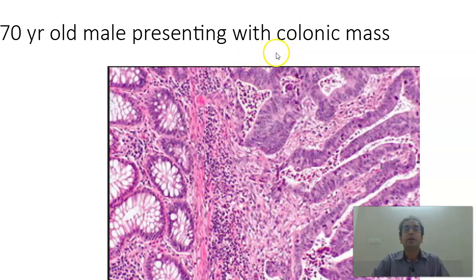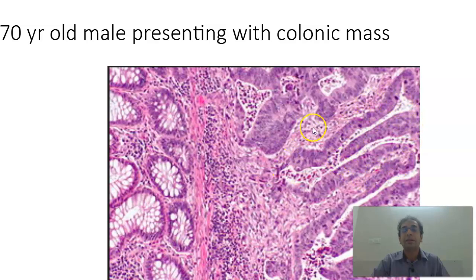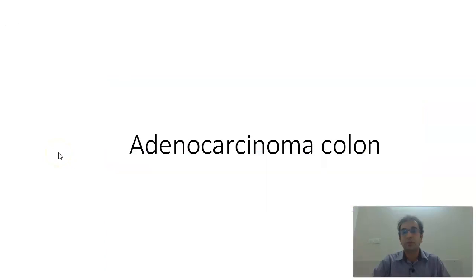Next, a 70-year-old male presenting with a colonic mass. At the MBBS level, a 70-year-old male with a colonic mass — you are dealing with an adenocarcinoma probably. What you find here is normal colonic tissue alongside atypical malignant glands with high nucleocytoplasmic ratio, nuclear stratification, and hyperchromasia. They are more darkly stained compared to the normal colonic glands. These malignant glands do not have mucus within them. This is the adenocarcinoma of the colon.